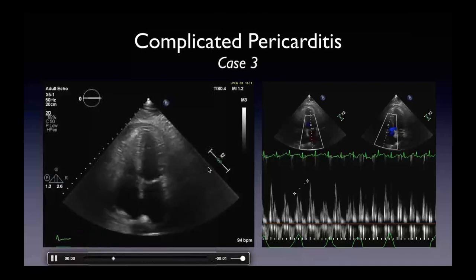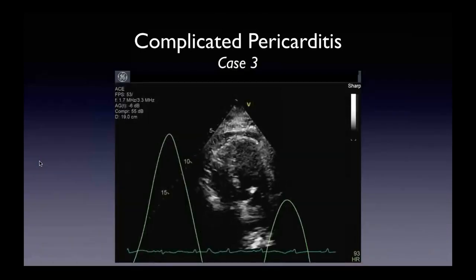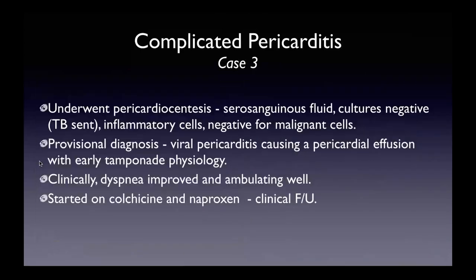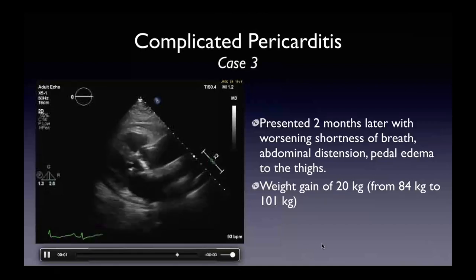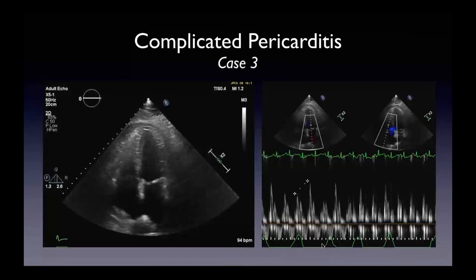And actually, if you go back and look at it here, once again, you kind of lose that sliding motion as the RVOT contracts as well. So something useful to look at. It's a bit of a subtle finding, but can be fairly specific.